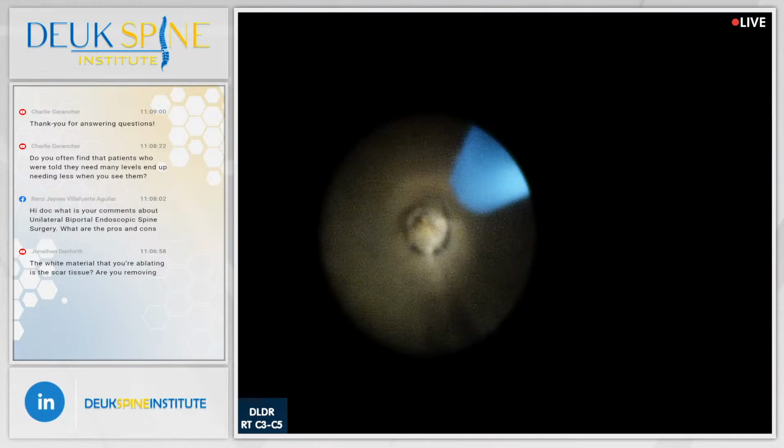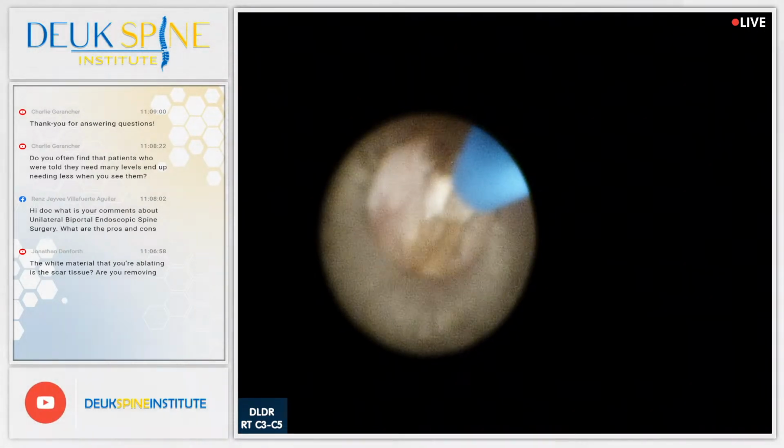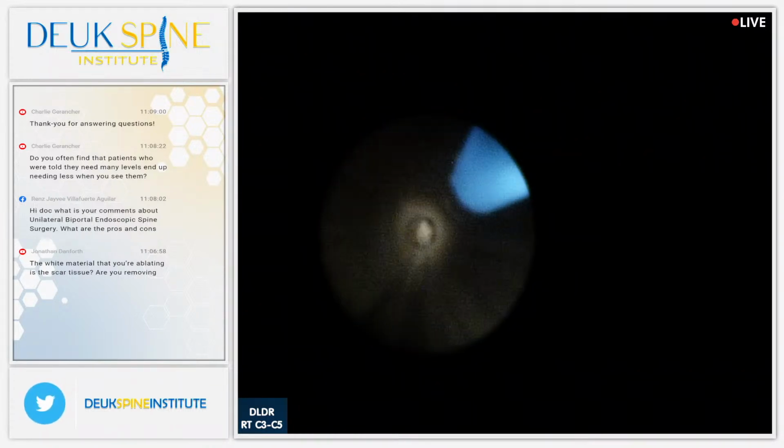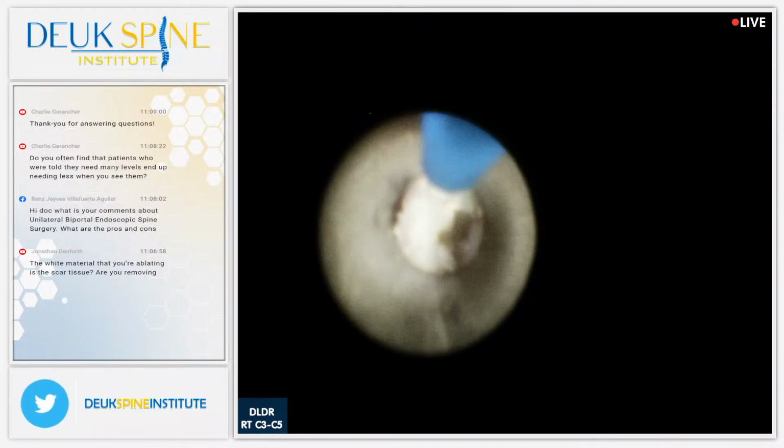Next question coming from Jonathan once more on YouTube. Hi, Jonathan, welcome. Saying the white material that you're ablating, is that the scar tissue? Are you removing disc material? Pardon my ignorance.